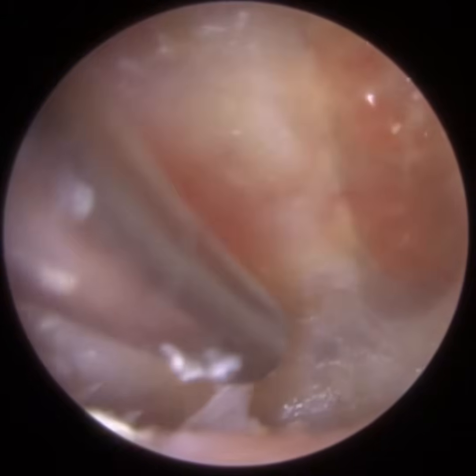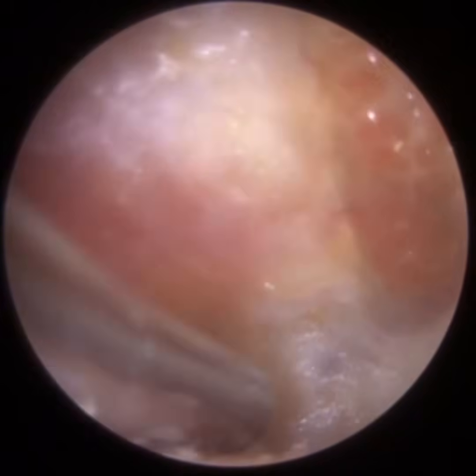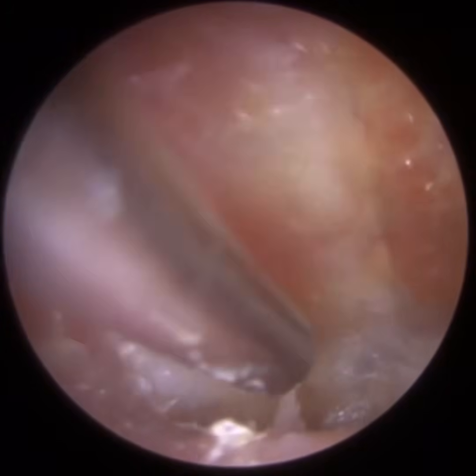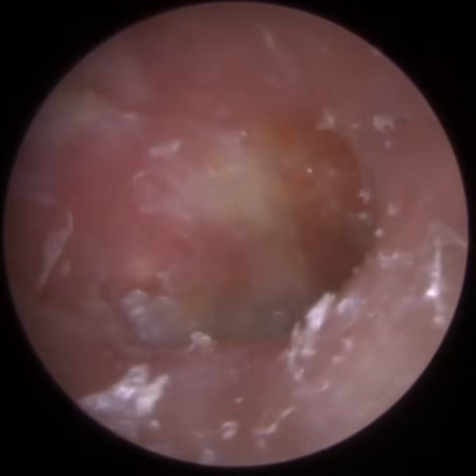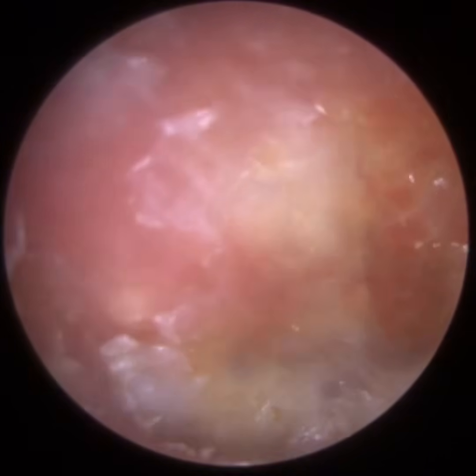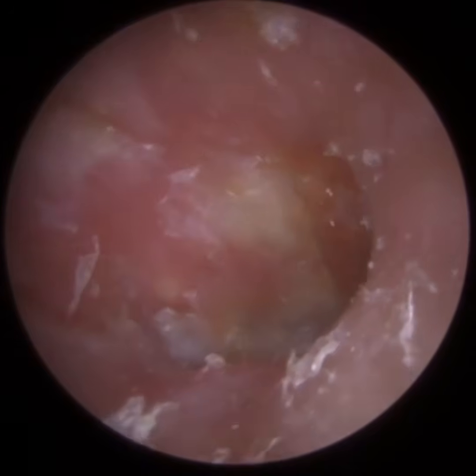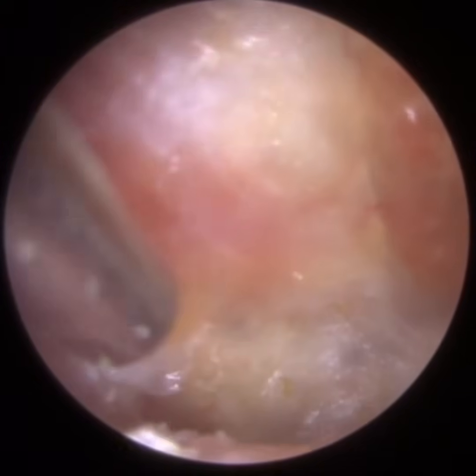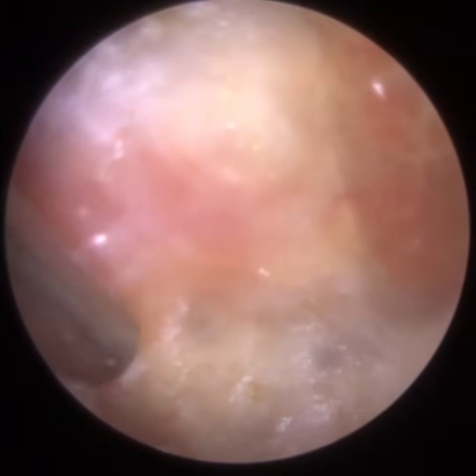So the patient has got a lot of scar tissue on the eardrum, which is not surprising really, because the left ear is the worst of the two, and they are prone. Obviously, they do suffer from chronic ear infections, which over time cause trauma to the eardrum, and you get calcification, so calcium deposits building up on the middle membrane, where the connective tissue and fibrous layer is, and that gives it the white appearance. We call that tympanosclerosis. In extreme cases, tympanosclerosis can stiffen the eardrum so it doesn't vibrate. Quite often when I've got patients with tympanosclerosis, you do a hearing test and it doesn't really affect them as much as you think it would.